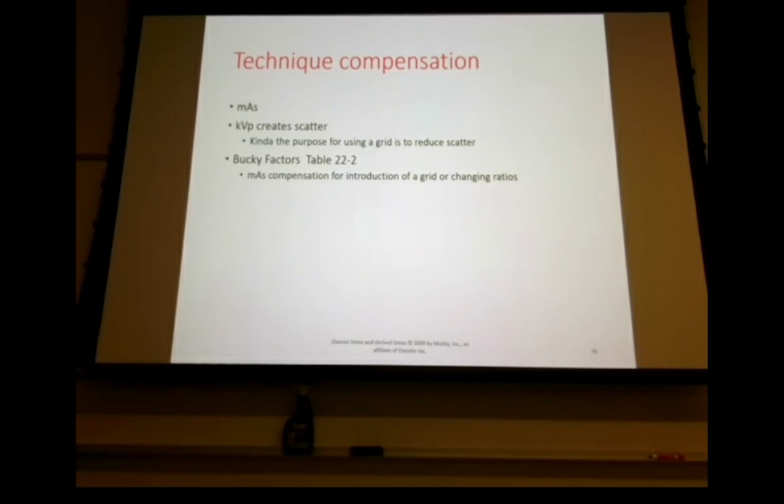The other things are that as the kVp goes up, as the grid ratio goes up, what's going to happen with patient dose because of the use of grid?